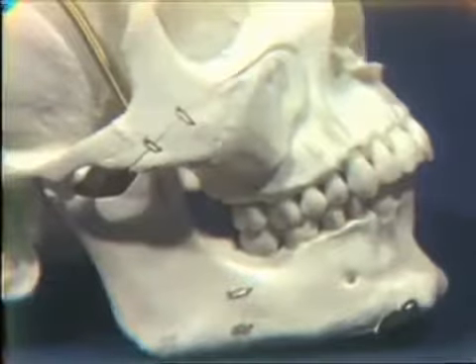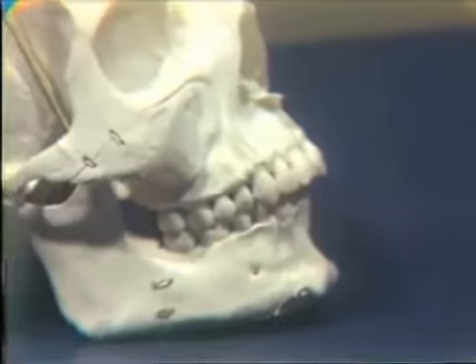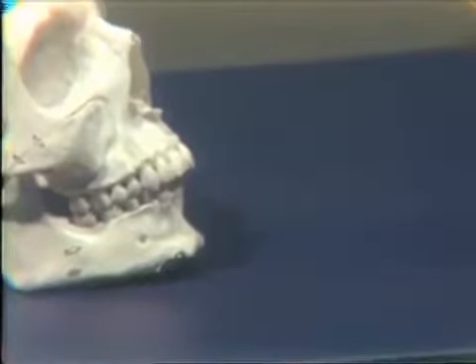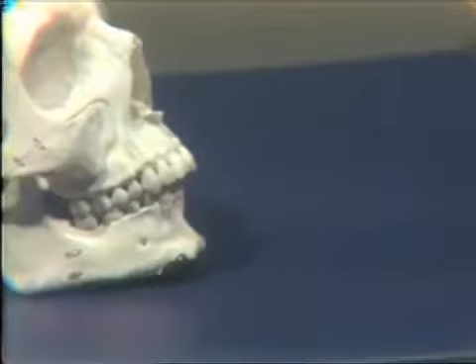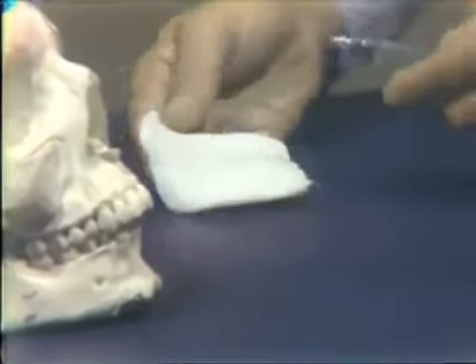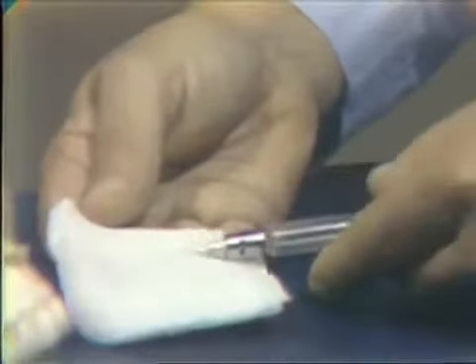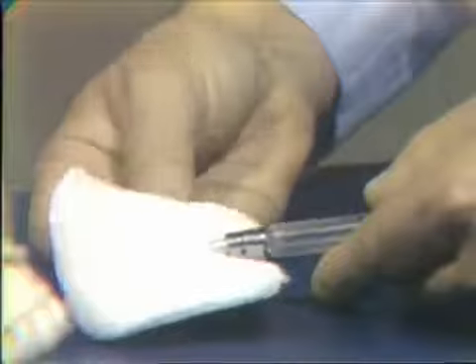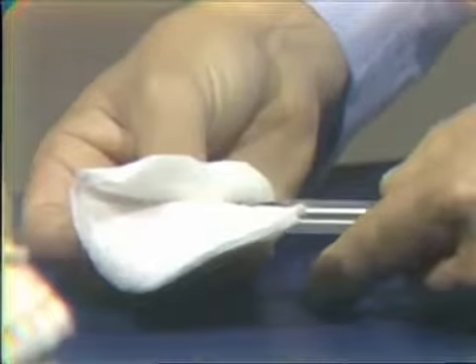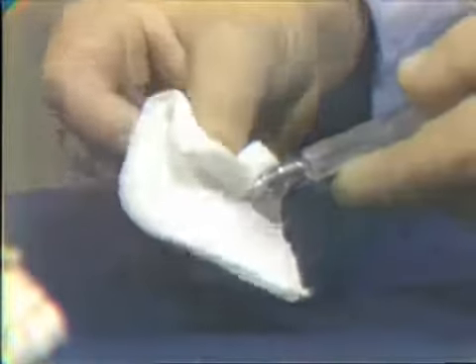I'd like to show you briefly how we curve the needle with a sterile gauze to keep the needle sterile so that we can keep close to bone as we approach the posterior superior alveolar foramina. You see I have a gauze square here in my hand, and we just lay the syringe and needle on it, and then I fold the gauze over it so that I'm engaging it with finger and thumb and still at the same time keeping the needle sterile, and I just give it a little twist here.